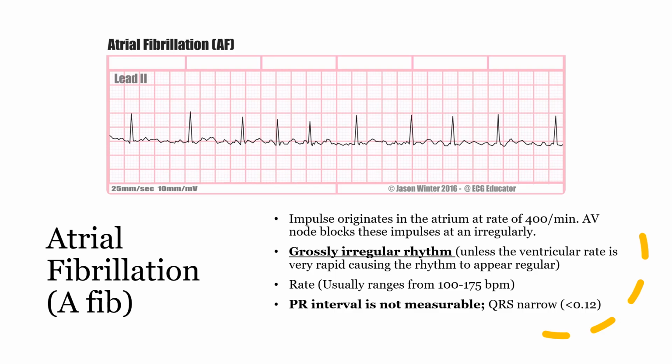Now we understand that the R wave, the QRS, is going to be the ventricles contracting. So this is actually going to be our pulse rate, what we feel. But keeping in mind that it is affecting the volume of blood and how much blood is going to be in the ventricles when they contract.